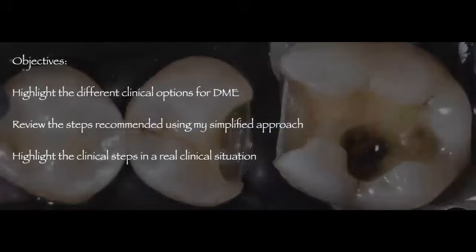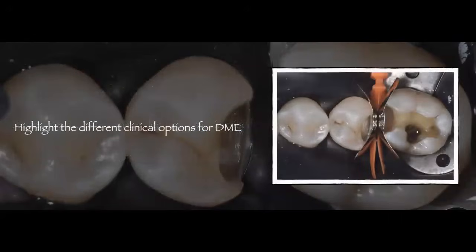So today's objectives are going to be very simple. First one, highlight the different clinical options for deep margin elevation. Review the clinical steps recommended using my simplified approach, and highlight the clinical steps in a real clinical situation. So let's get started with objective number one. Highlight the different clinical options for deep margin elevation.